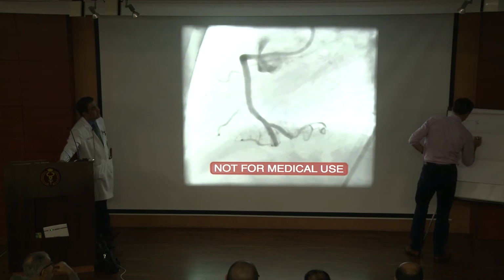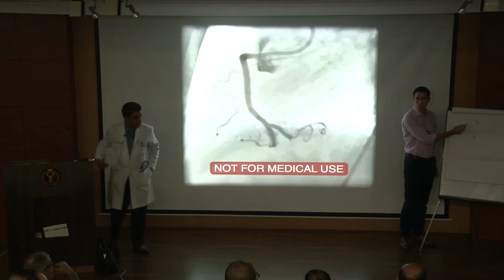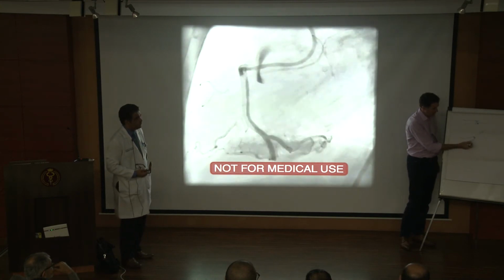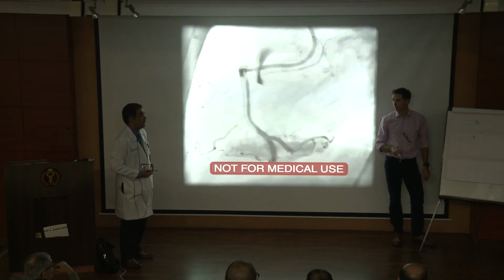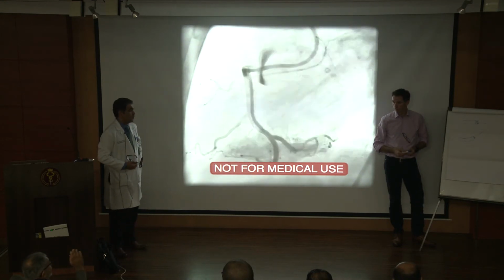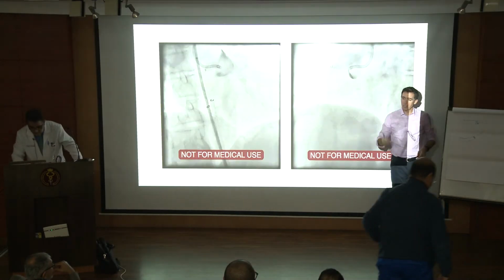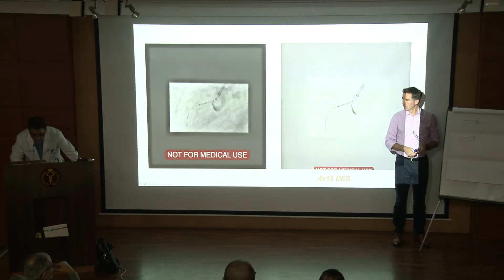No, you're very elegant, but if your stent is like that, you're missing the ostium. Yes, and this is what you're referring to, isn't it? Yes, it's pointing up. Once you see the proximal end of the stent lifting up, you're right at the ostium. Correct. So you just basically rely on position and expectation. If it's like this, if it's at right angles, you're in too far. You need to pull back, and of course it's very difficult to do that with an AL, because the AL's either all out or all in. Colin, this shows it.